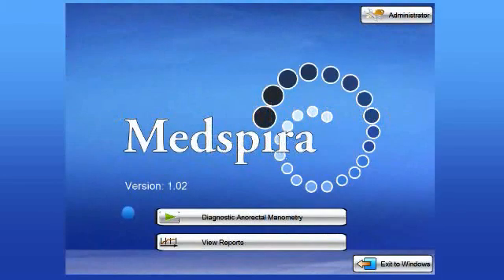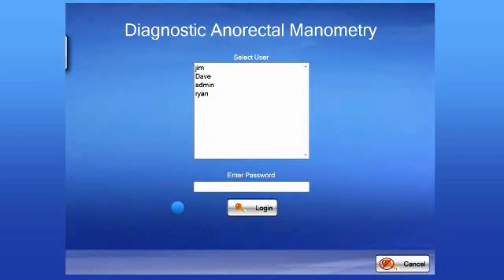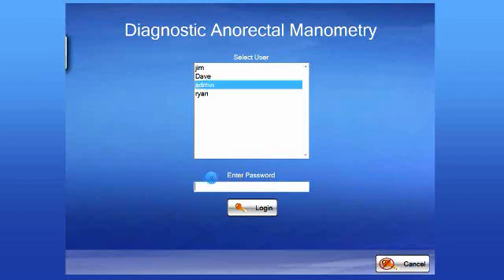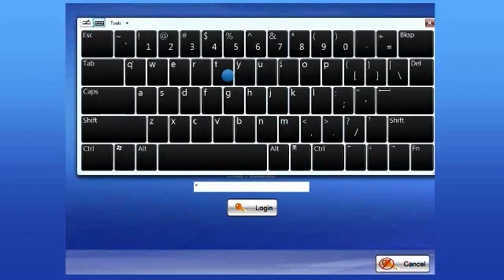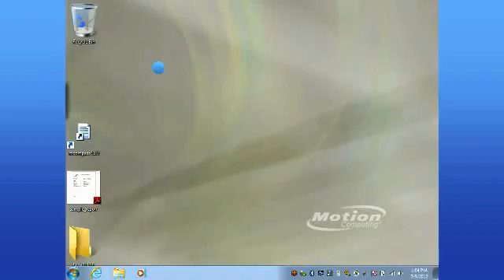Let's begin the diagnostic manometry testing of the system. You enter it by clicking the icon on the main screen. Here is where you would enter your user name and password. After tapping log in, it will bring you to the patient data screen.